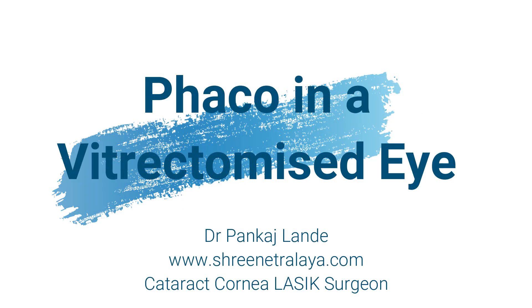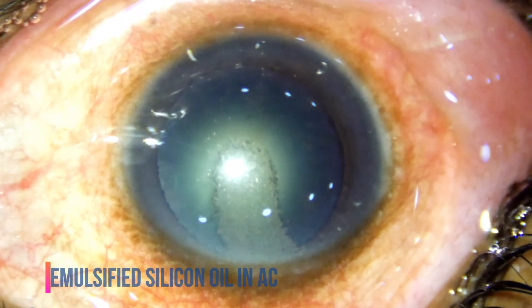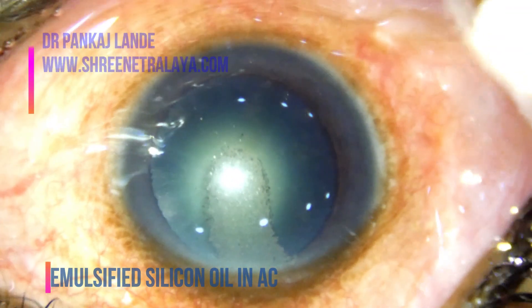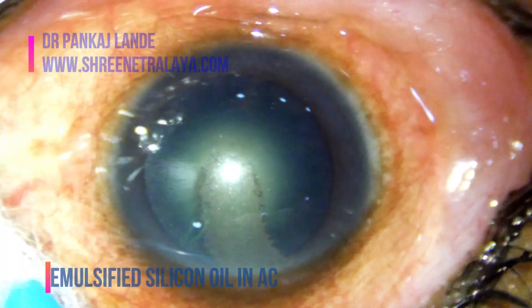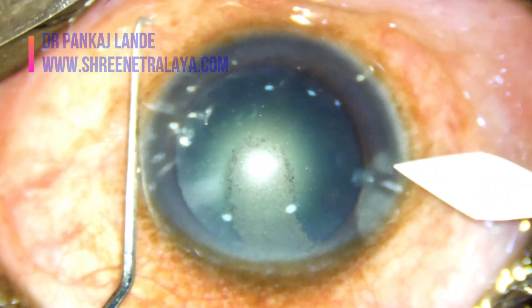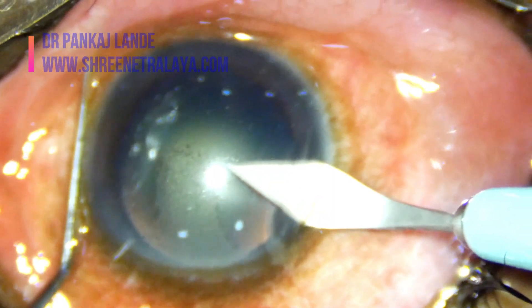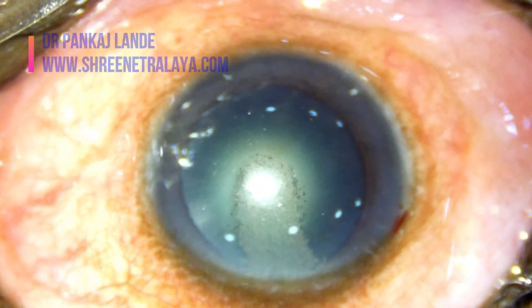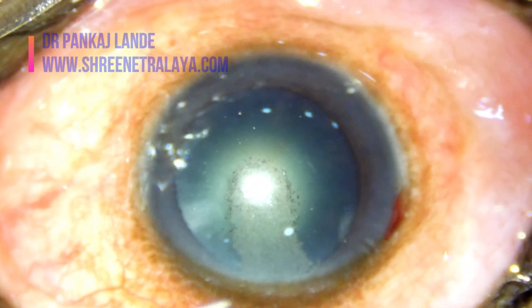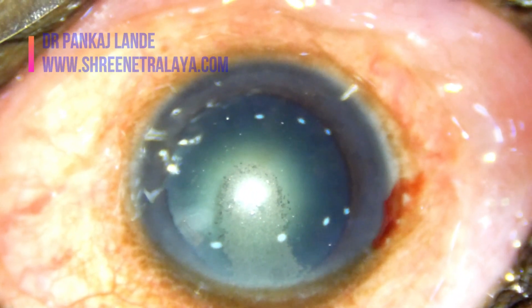Hi friends, welcome to Srinit Ralya. In this video I am going to discuss phacoemulsification in post-vitrectomized eyes. This case was operated for RD surgery two years back and silicon oil removal was also done. As you can notice, there is a slight amount of silicon oil in the anterior chamber.